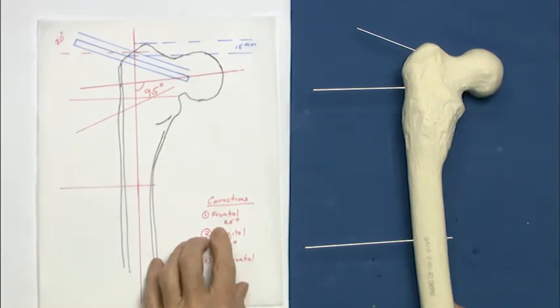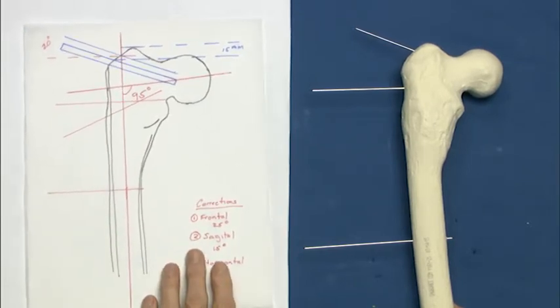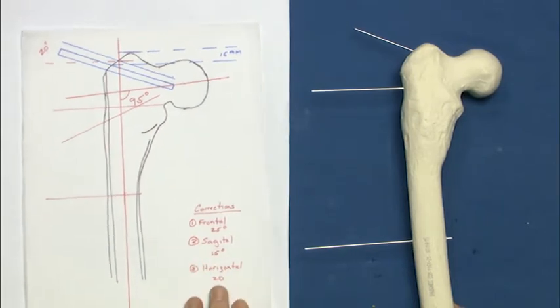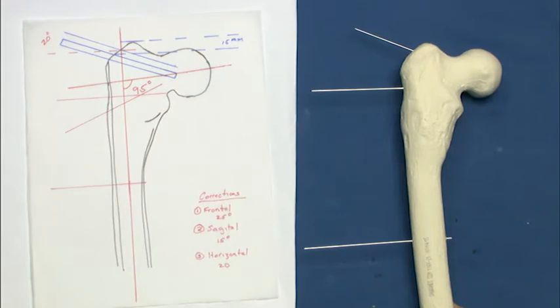Currently, we're only working on the frontal plane correction. And we're going to go next to how, as we put in the seating chisel, we're going to compensate for the sagittal plane. And the horizontal plane will come as a compensation with the closing wedge, which will be done after the transverse component is completed. And then we'll carry out our 20-degree medial rotation of the distal segment before we cut the closing wedge.